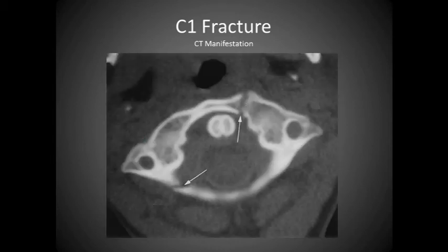Okay. Additionally, we have another C1 fracture. We have these areas here. Notice how the fracture is going to appear as hypodense in comparison to the bone that's surrounding it. Going to appear pretty much isodense as this muscle here. And so that's what we see. You're going to look for a line running anywhere inside of the vertebrae.